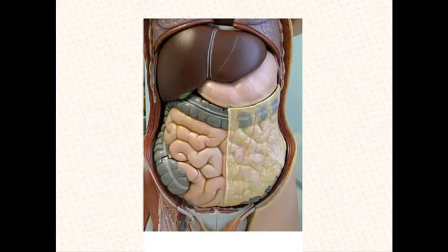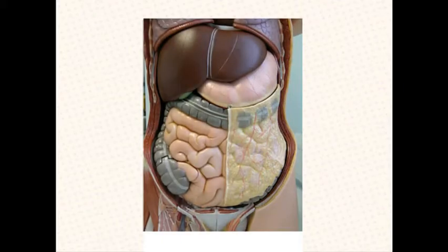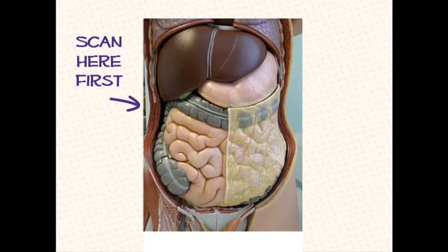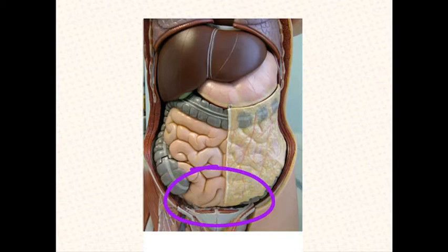Free fluid in the peritoneal cavity will flow throughout the abdomen preferentially in the relatively unobstructed right and left paracolic gutters. Of these, the right paracolic gutter is deeper and wider, making fluid more likely to flow here, and therefore making the right upper quadrant the most likely location to accumulate blood in acute hemorrhage. In addition, the phrenicocolic ligament blocks some flow to the left upper quadrant, making the accumulation of fluid there slower. Blood may accumulate in the pelvis, either by a bleed originating in the lower part of the abdomen or by overflow from the upper abdomen as it tracks along the paracolic gutters.